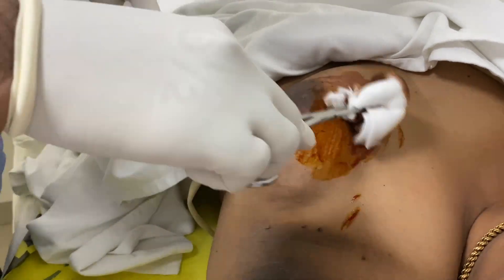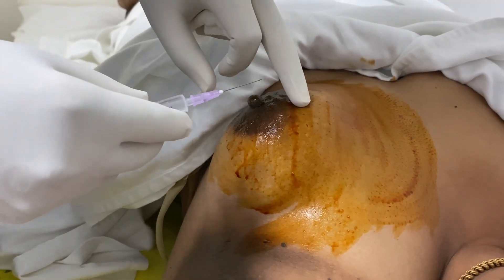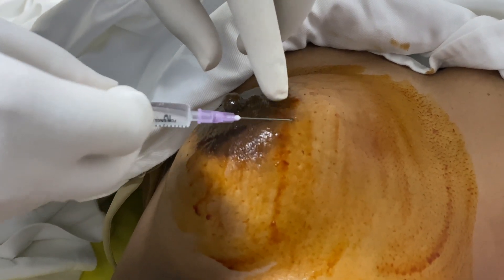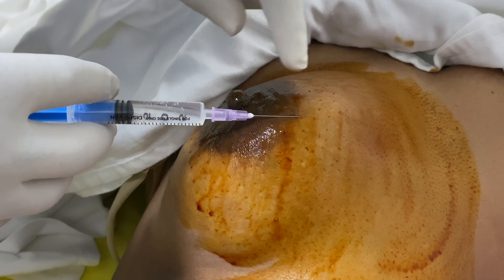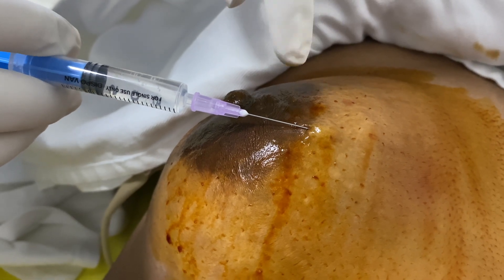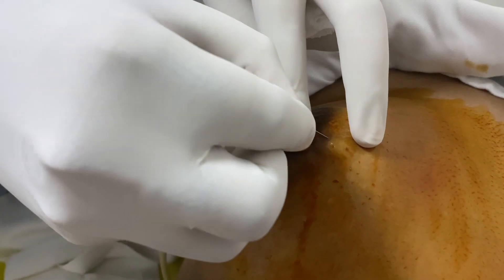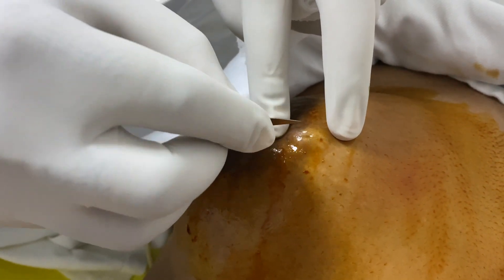The first step of the biopsy is to clean the skin with Betadine or antiseptic solution. Give a small amount of local anesthetic just below the skin, maybe 0.5 ml. Then make a 1 to 1.5 millimeter opening in the skin with a number 11 blade.